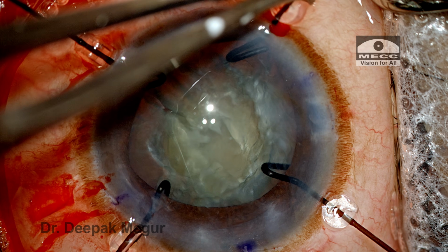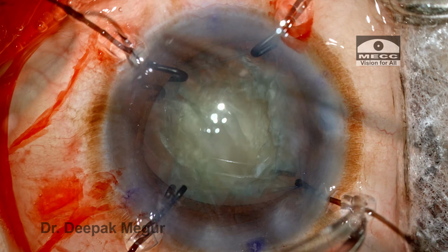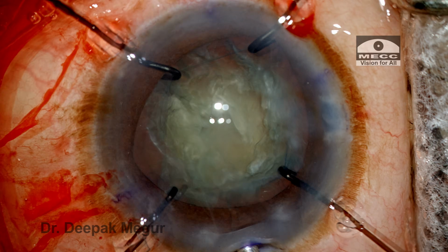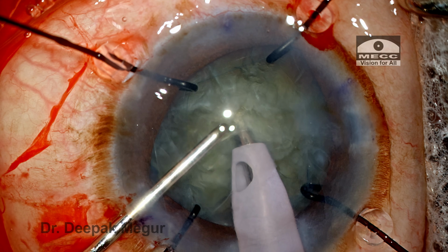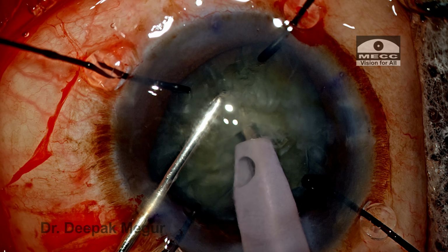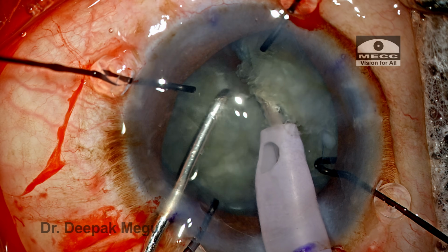At this stage, I noticed that the capsule hooks are disengaged. So I need to go in and re-engage them and also re-tighten them a bit. The strategy of nucleus management is to do the vertical chop. Divide the nucleus into multiple smaller fragments and then emulsify them one by one.